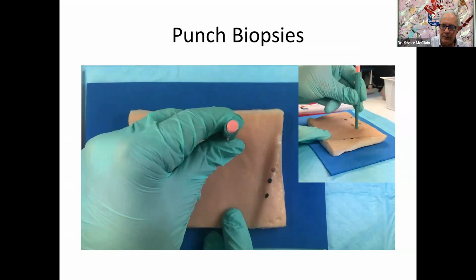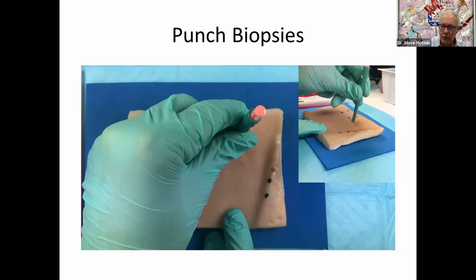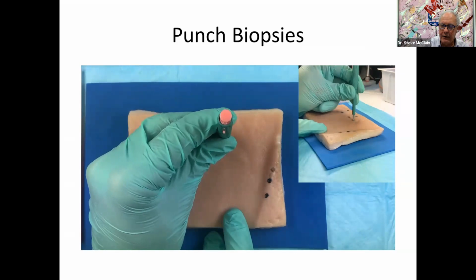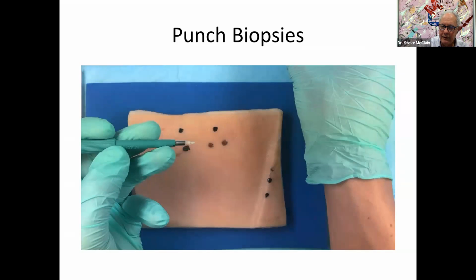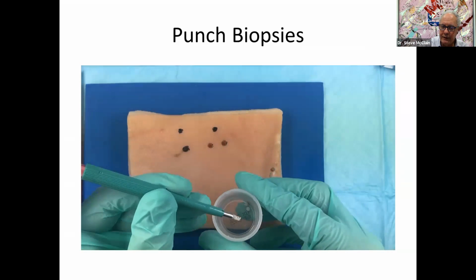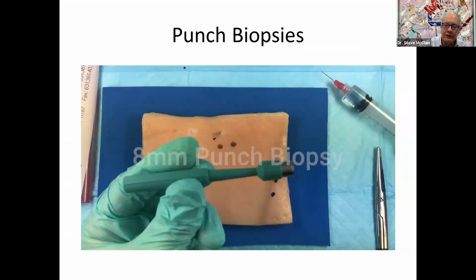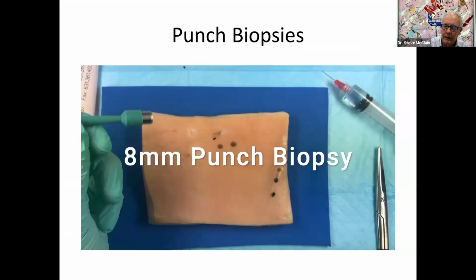Now that last little bit, when he tilted it both ways, he cut the pig skin off at the bottom. Now you pull it out, and you should have your little punch of tissue in there, and you squeeze it right into the formalin bottle. No crush artifact, no problem.